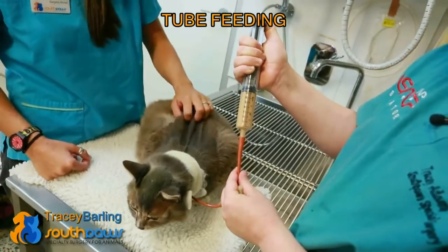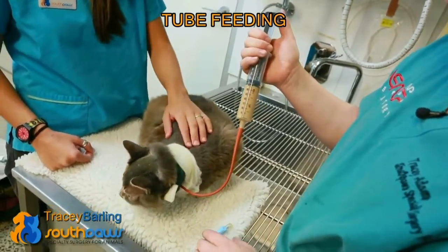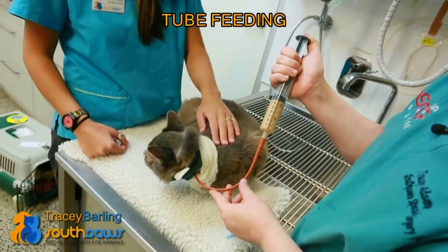You attach your catheter tip to the feeding tube. This needs to be given over about five to ten minutes, nice and slowly. Most patients tolerate it really well as long as you're doing it slowly.